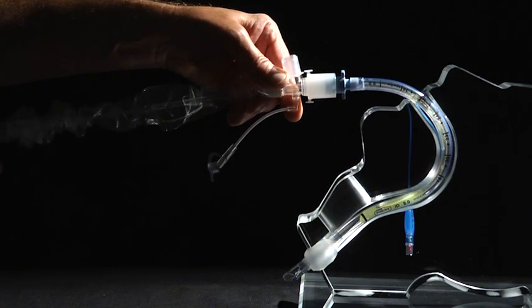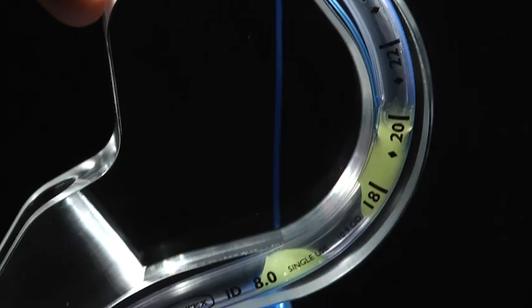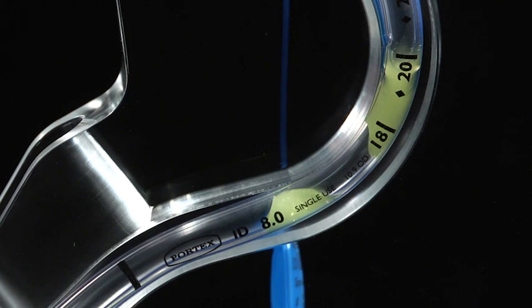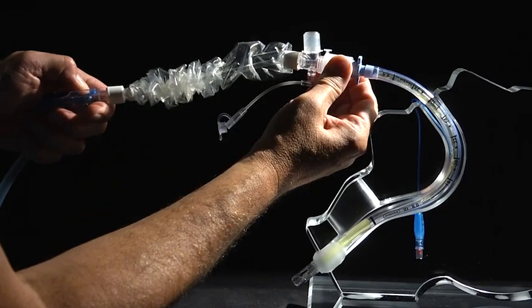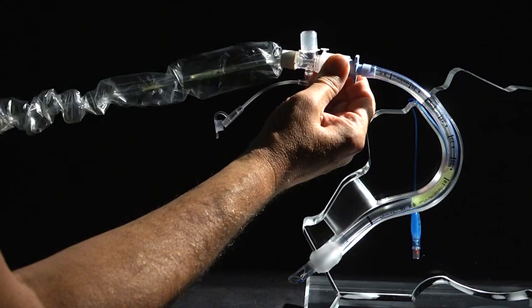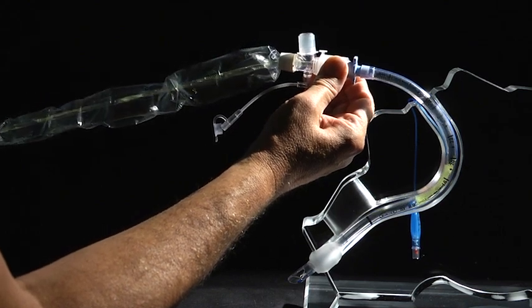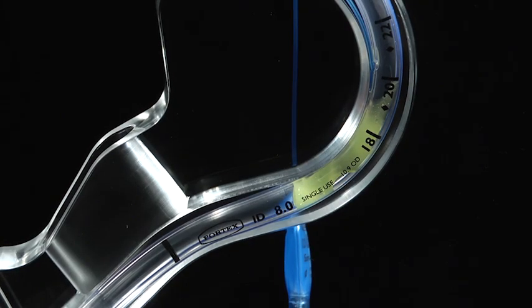The first pass of the suction catheter removes some secretions, but also mobilizes them so if left behind, they can migrate into the distal lung fields. The second pass also leaves secretions behind that would not be visible in the patient like they are in this see-through head model.